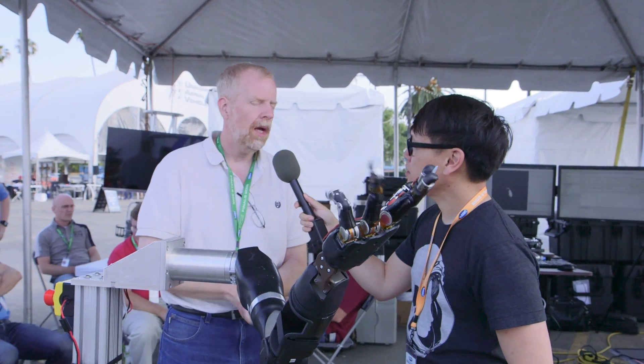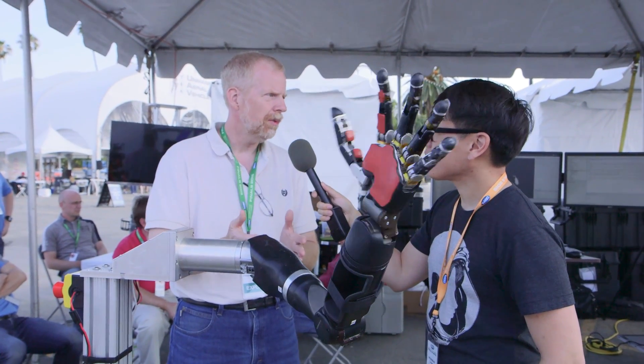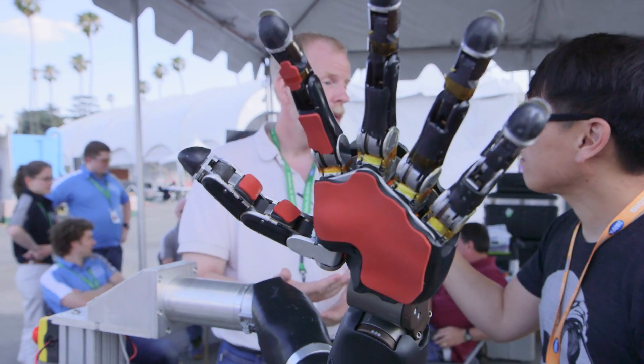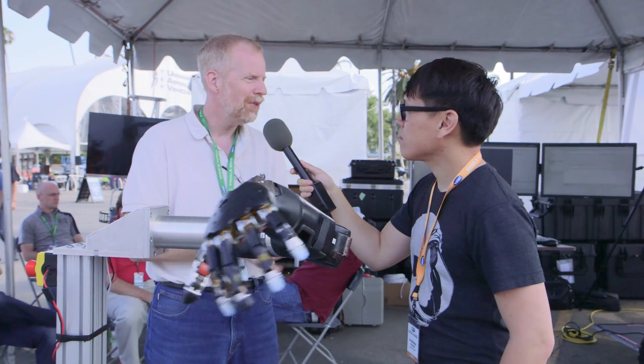We operate in environments that were designed for humans, so we don't want to have to redesign them so the robot can operate in that environment. What we wanted to do here was to create a robotic system that mimicked the human hand — initially to replace the human hand, but ultimately put that into a robot system that could operate in environments designed for humans. It should be able to do things like type on a keyboard or do very fine manipulations that robots today cannot do very easily.